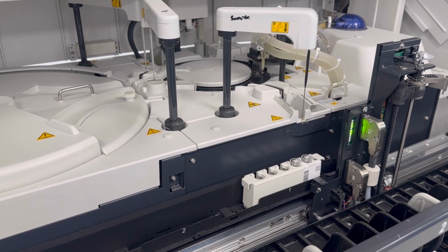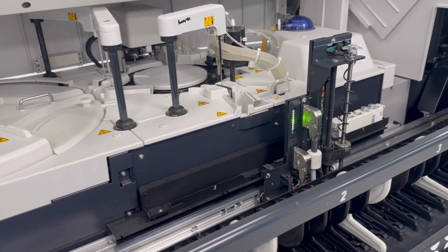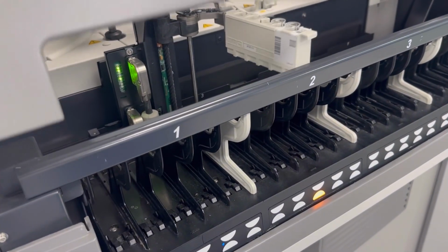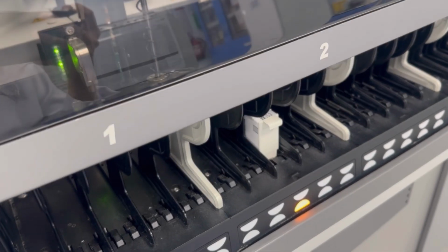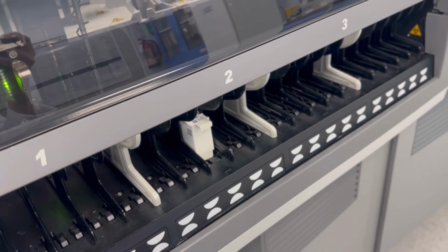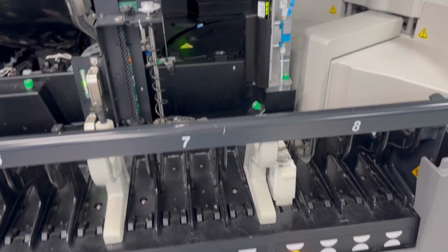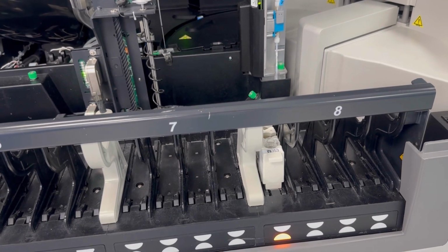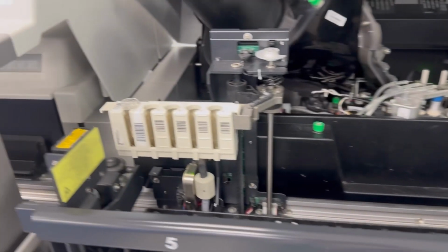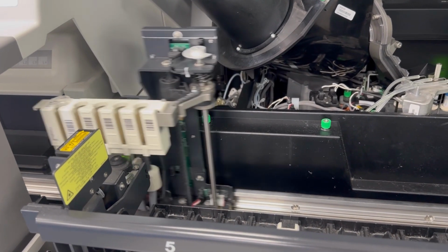So now the machine will take the sample rack and put it back here. If it is an orange light, it means the sample is being processed. If it is a green light, it indicates that the process of the sample has been done. This is how you can tell. The orange light means the process is still ongoing, and if it is green light, it's an indication that the process has been done. So now you can remove the rack.